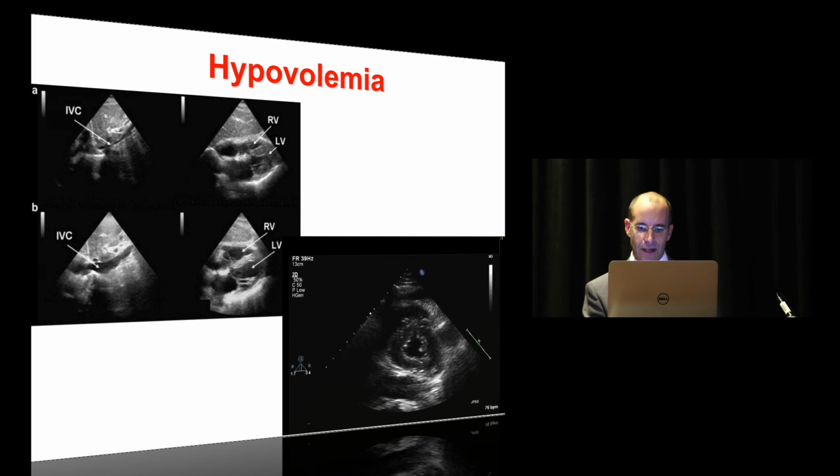So this is a parasternal short axis. And what you look for is seeing how it's contracting. So in a situation that I saw this, I would look at the wall contracting. You try and look right in the middle to see it's concentrically contracting in towards that central point. So you know that there's likely no regional wall abnormality within the view that you have.